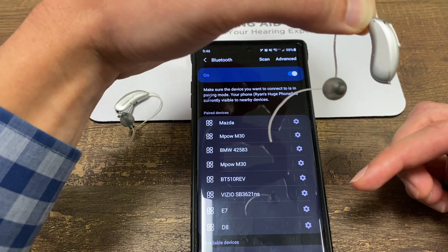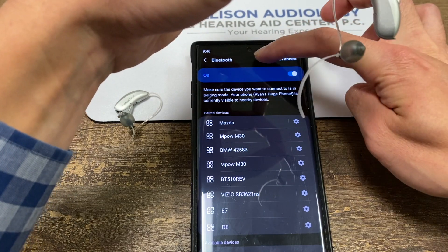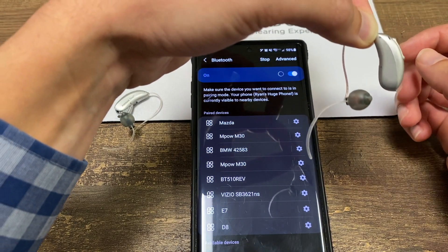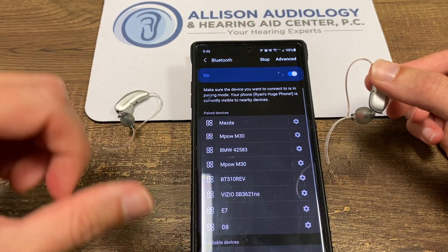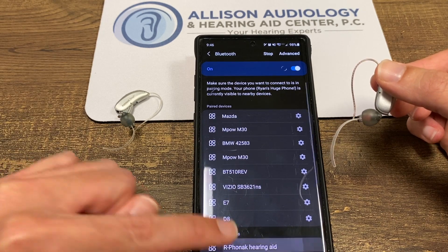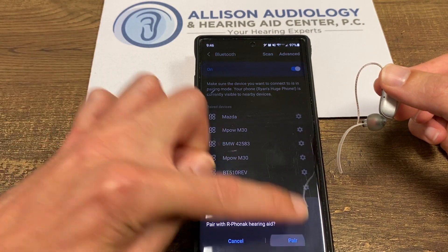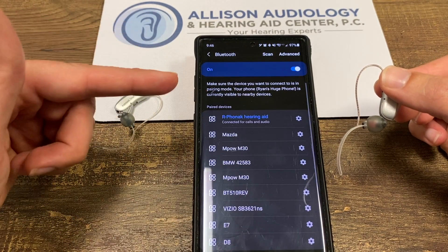This one has the battery, so we're going to pair this hearing aid up. Make sure it's scanning. The phone will say 'R Phonak hearing aid.' We'll touch on that, it'll ask to pair up. We're going to pair, and now it's connected.